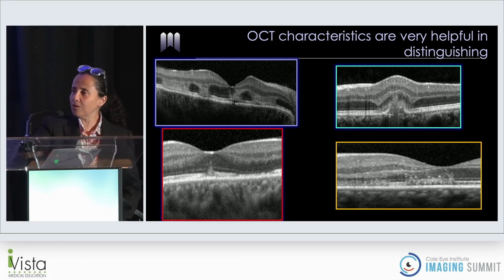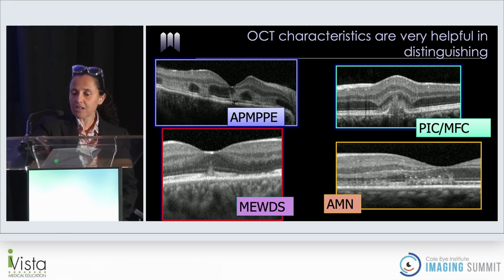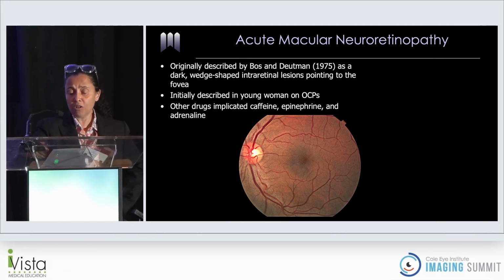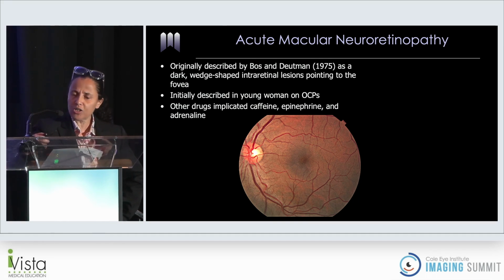You see exactly where the lesion is, and they don't look similar at all. They're completely different, especially if you have follow-ups and you see where the lesion started. These lesions are easily told apart by OCT. So that's the gist of this. Now you have to redefine these diseases by OCT, and I think the IOSG group is going to come out with a whole spectrum of disease in AJO this year using multimodal imaging.